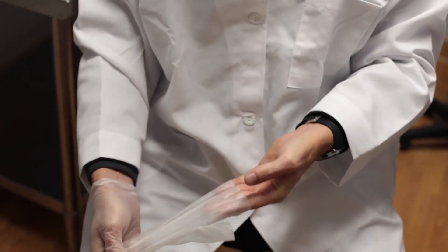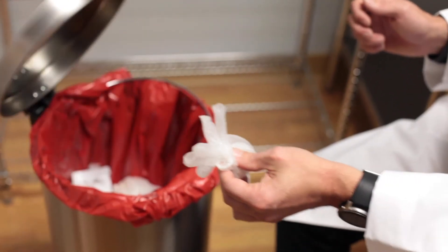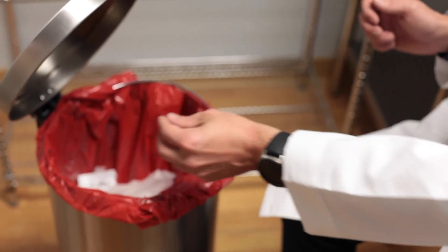Once this is complete, properly dispose of your gloves to avoid any cross-contamination. Your collection is now complete and ready for the extraction process.